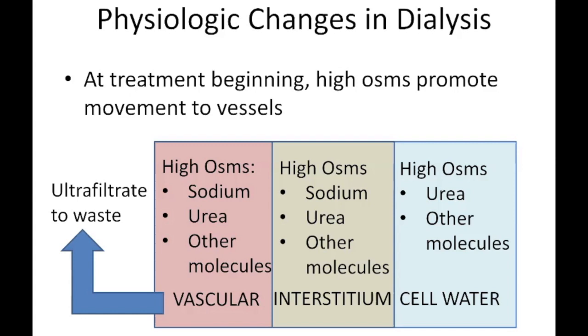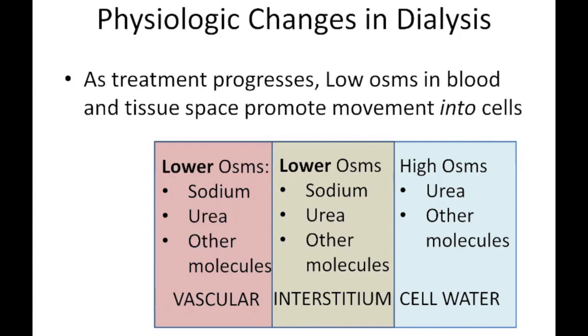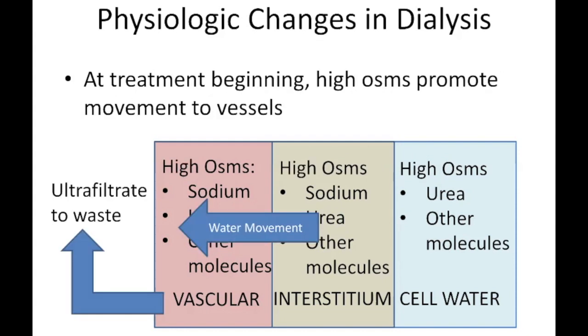The drain line in your typical dialysis machine will go to the toilet or to the sink in the ICU rooms, and that's very typical. As we're removing fluid, though, we're changing solute concentrations, and that's going to engender fluid movement. So let's look at what happens here. Here, we're pulling water from this space directly. We have our catheter in the right atrium, or we are removing fluid from the fistula. So we're removing this filtrate of blood. This is the space we're directly removing water from. We're removing basically plasma water, and then the interstitial space is refilling that vascular space.